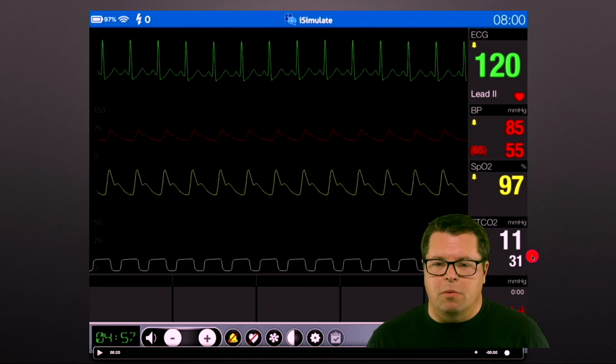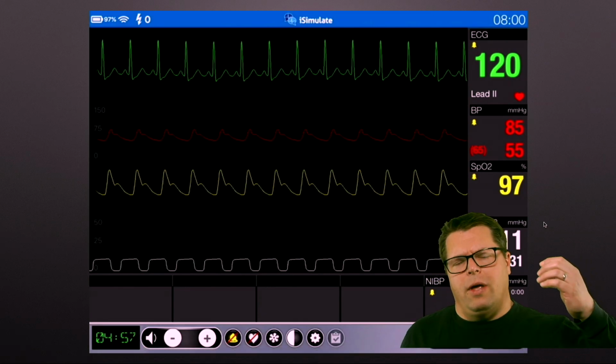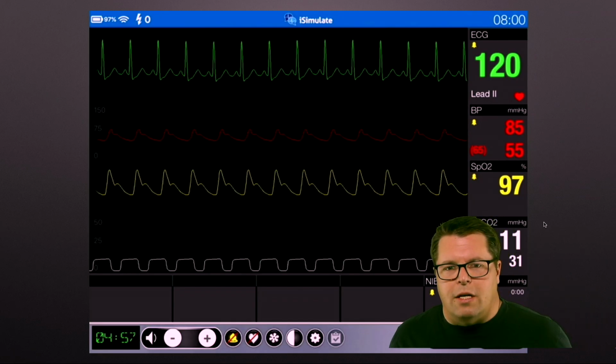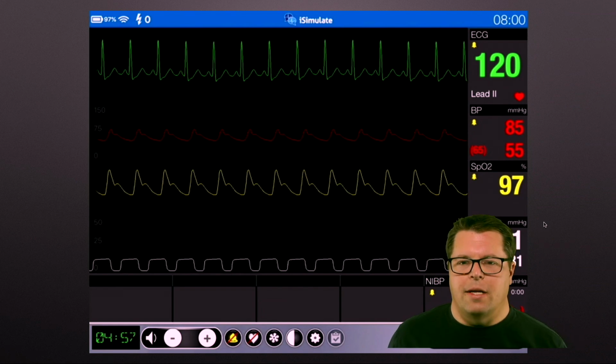And here his respiratory rate is not only higher than 20, but his end tidal CO2 is way low. And so you look at that and you remember Walt saying, oh yeah, that means that they're not getting blood flow to their head, so I'm doing a bad thing. So then, because you have control of this guy's respiratory rate at this point, you slow him way down, and you start bagging him at about 10 times a minute.